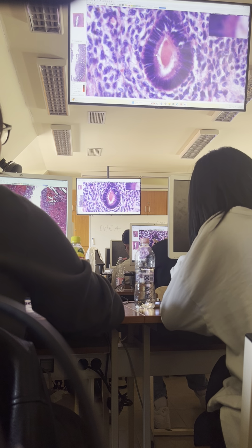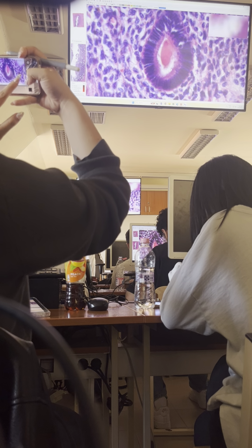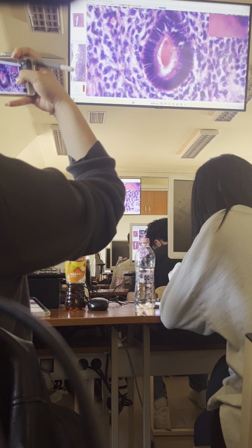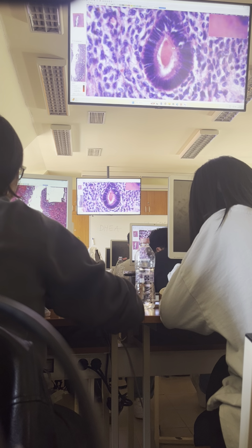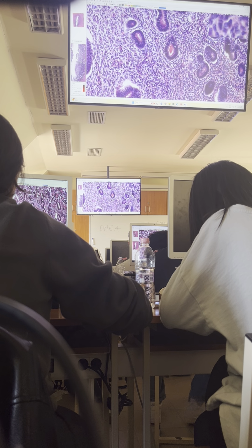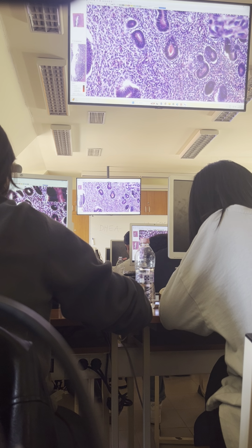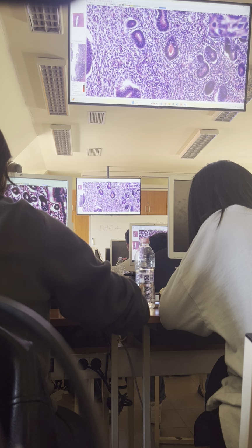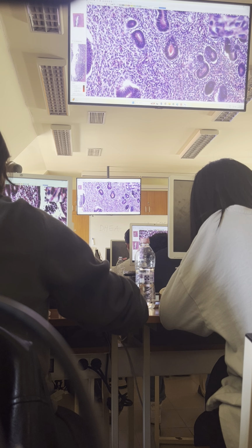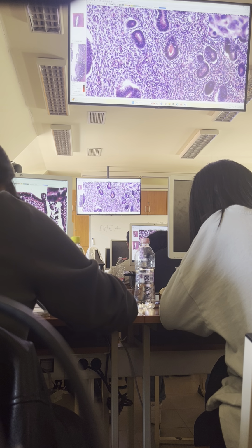This will change in the progesterone phase. Also the lumen, the border of the lumen is quite regular. This will also change in the progesterone phase. It will be much more irregular. Now the cells here in the endometrium are connective tissue cells because this is connective tissue. But in this organ, we call these cells stroma cells. Stroma cells collectively.